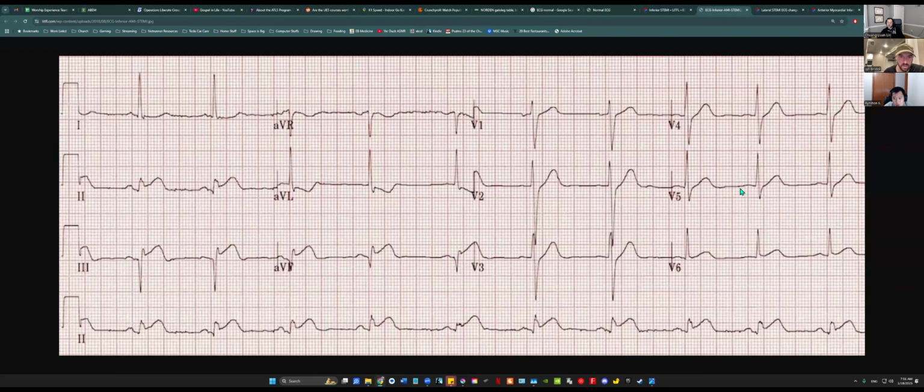How about the other left lateral leads, V5 and V6? That looks like a very slight elevation. Yes, elevation, see right there where the mouse is. So for this guy, because you're going to talk to me about the inferior STEMIs later, this inferior zone that's affected is starting to reach out to the left lateral.